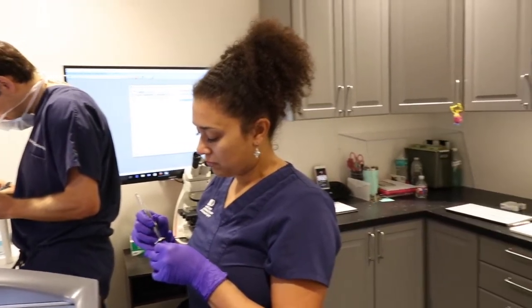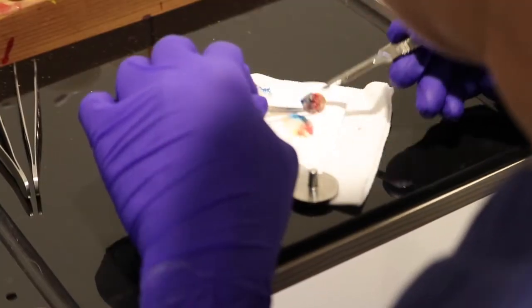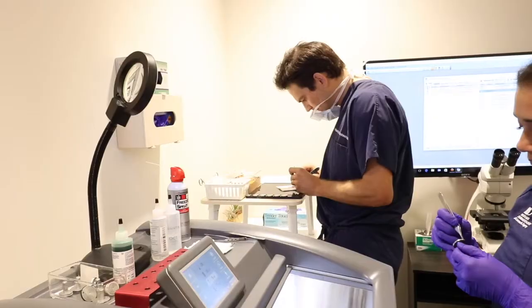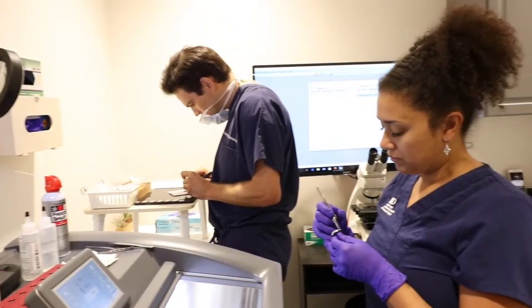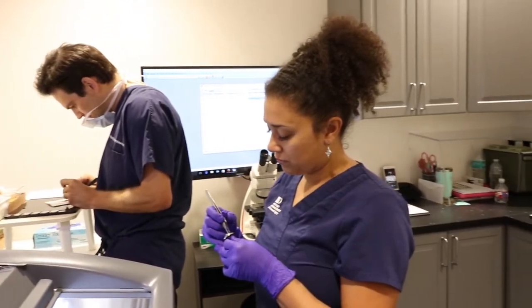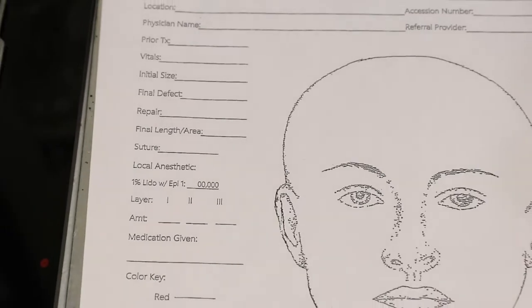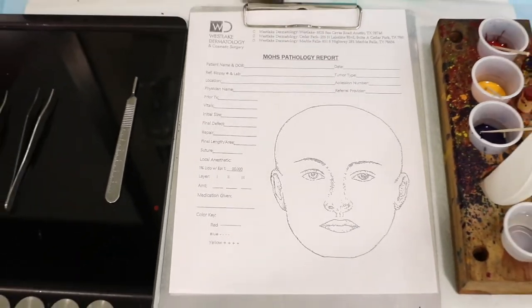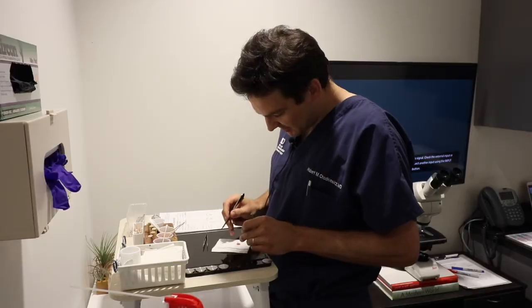In the lab, the critical step is marking and mapping the tissue in a way for me to go back to the patient if needed and target the areas where there's remaining tumor. Similar to a map that you use for directions, it's the exact same philosophy here with the Mohs surgery.